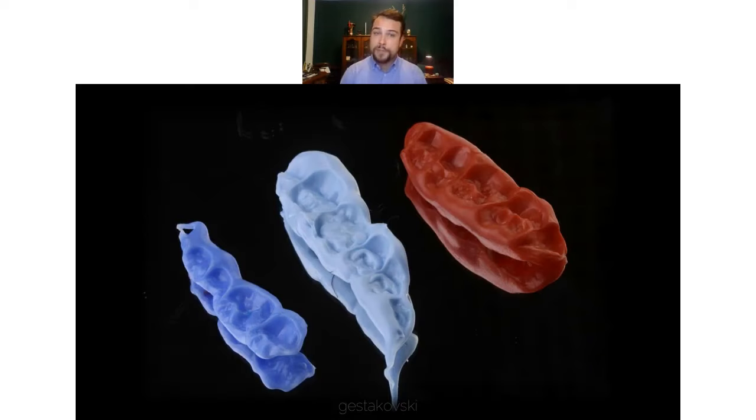When we speak about a different bite registration material, you can use acrylic material, you can use silicone material, thermoplastic material. I use the first one nowadays, but in some situation you will use the other one. It's totally case dependent. Have in mind that you want to have only stable reconstruction of the position of upper and lower model, like it is in the mouth.